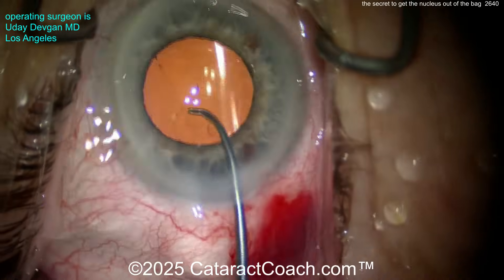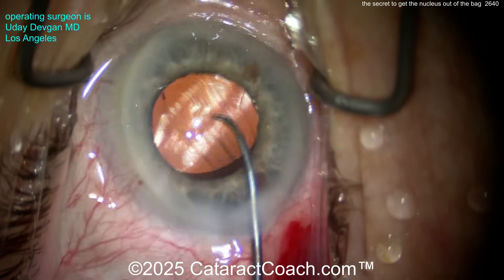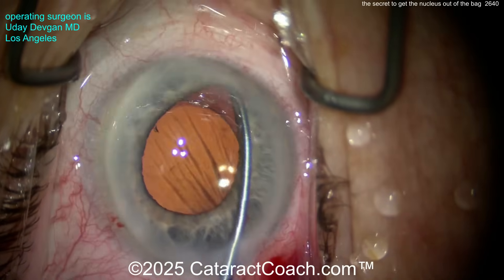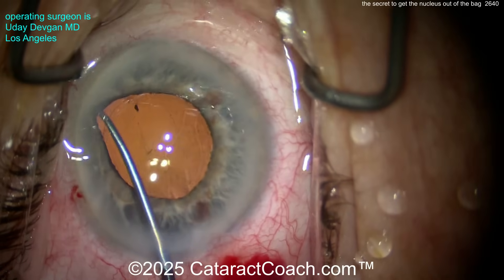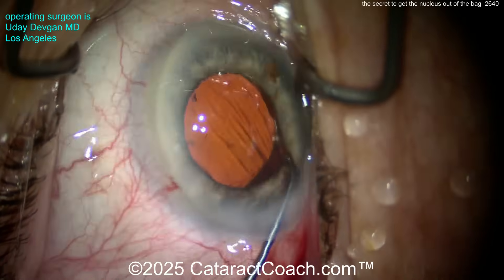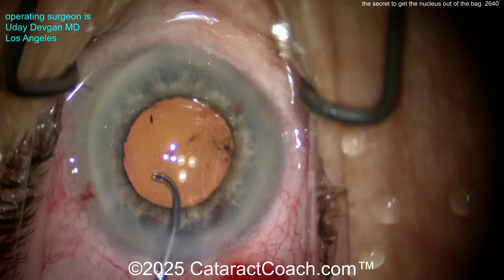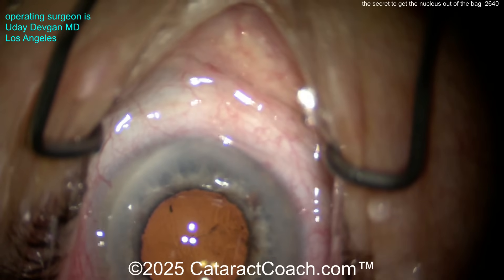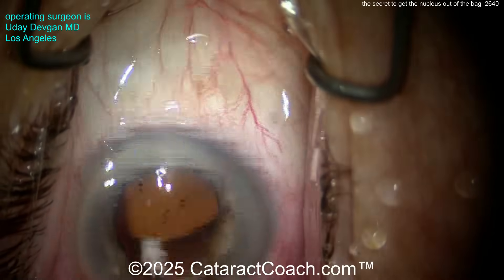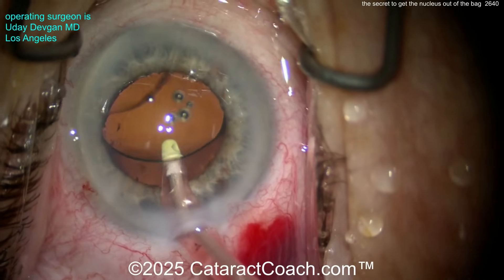It's a 6mm optic — let's make sure it's under that rhexis. Get this thing dialed around; be 100% sure. Lift up the iris and check. Yep, it's under the rhexis for sure. There's no residual cortex — I like to check a full 360. The lens is 100% in the capsular bag. There is no retained lens cortex or lens material. Let's remove the viscoelastic — we can still go behind the optic. Remove all that viscoelastic, and we're going to call this complete.